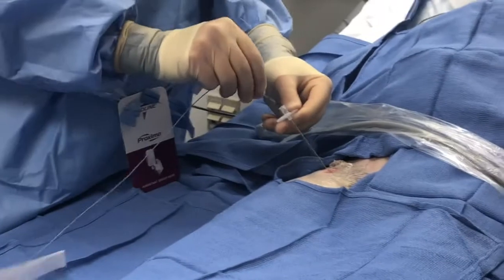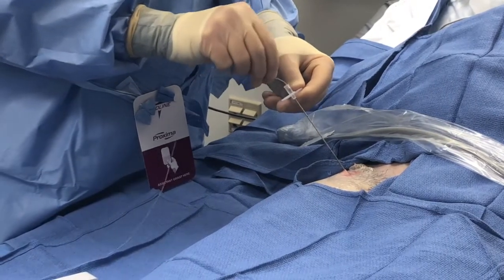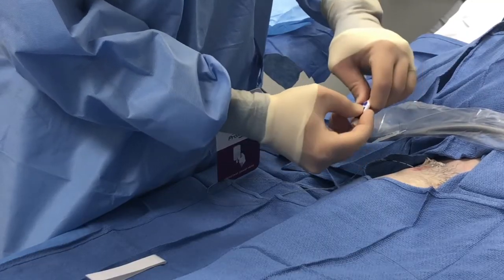Place the ONQ catheter through the Tuohy needle. You will feel a slight resistance as it passes the angle of the needle tip. Pass slightly further and remove the Tuohy needle along with the catheter stiffening wire. Connect the stingray cap to the ONQ catheter.